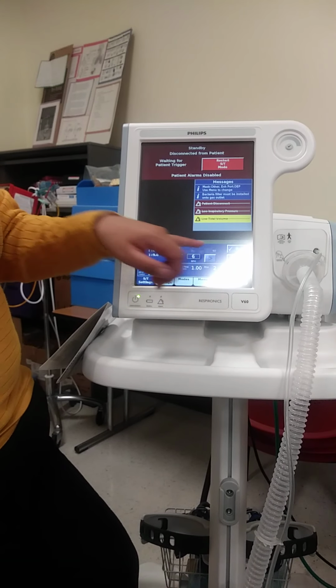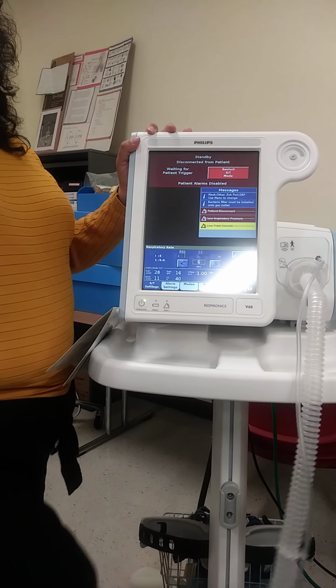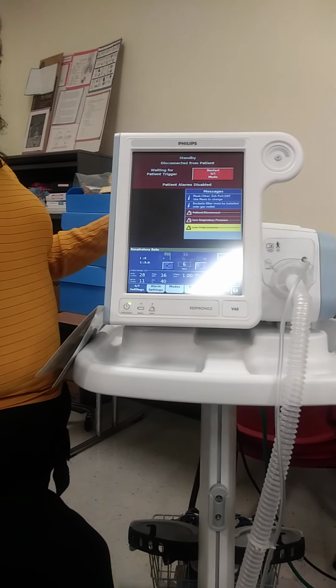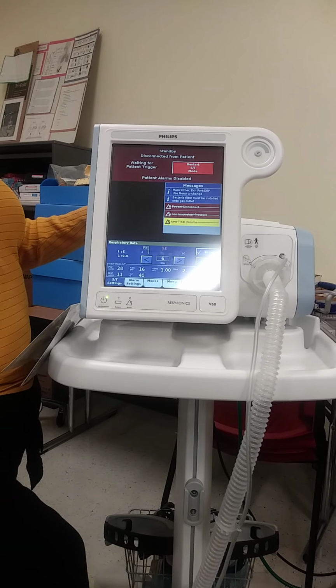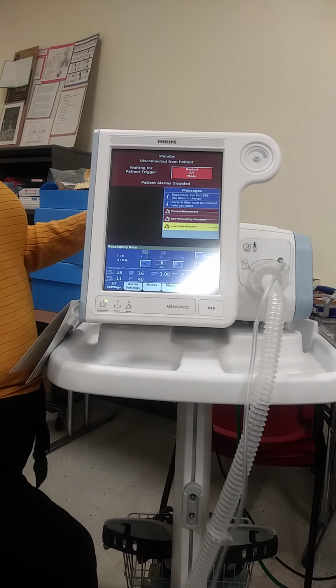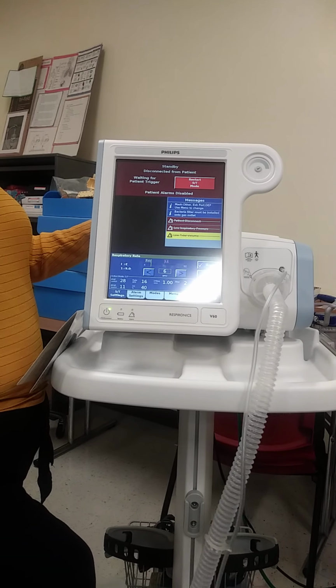Is that on top of what they're already breathing? Exactly. So if you put somebody on there who's breathing like 40 breaths per minute because they have a really bad COVID pneumonia and they're huffing and puffing, do you think I would set this lower or higher? Lower, right?